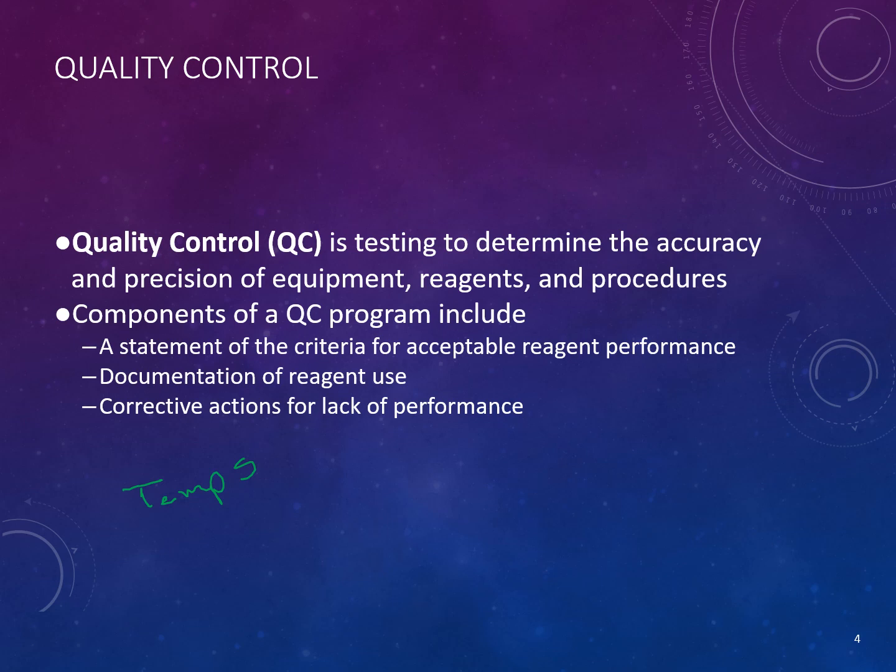Other things you might have to check, whether it's daily, weekly, monthly, whatever your schedule is for your lab, would be things like the speeds on your centrifuges, to make sure that they are at the proper speed and properly spinning your samples down, or your test tubes when you're doing a tube blood type, in order to get the intended reactions.